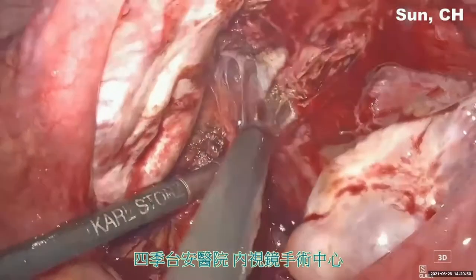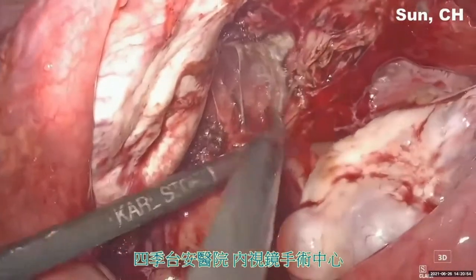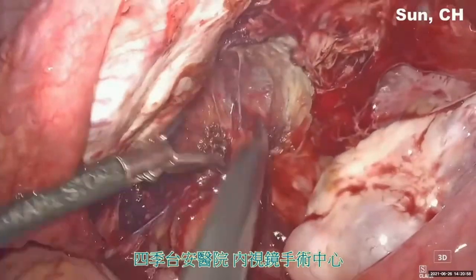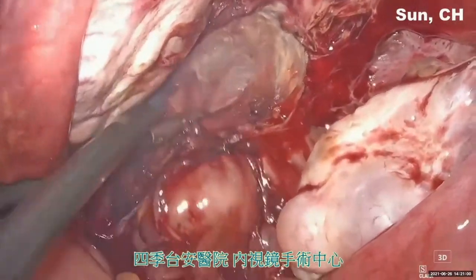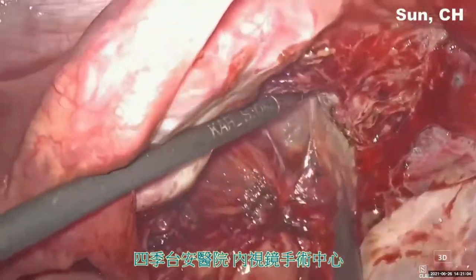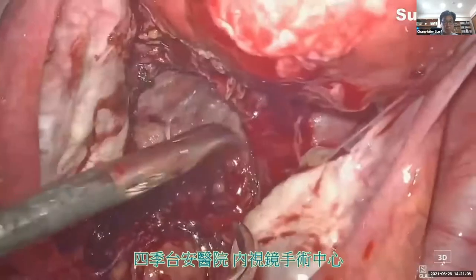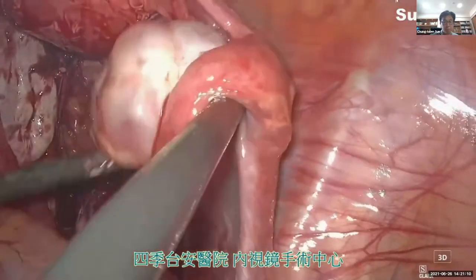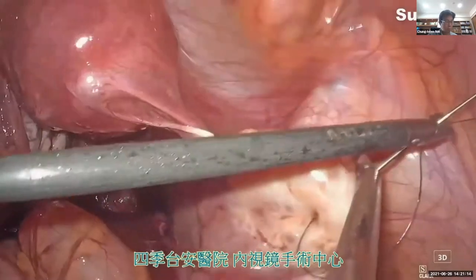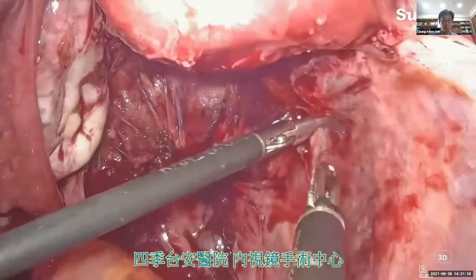Now we detach the rectum away from the right uterosacral ligament. Now the posterior cul-de-sac was totally opened, and we are going to suspend the ovary so we can have a clear view.